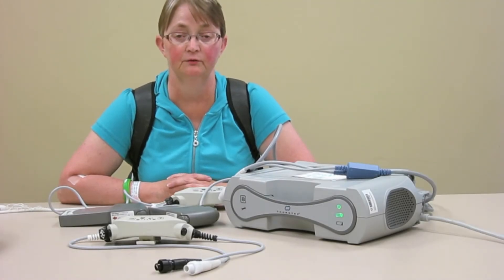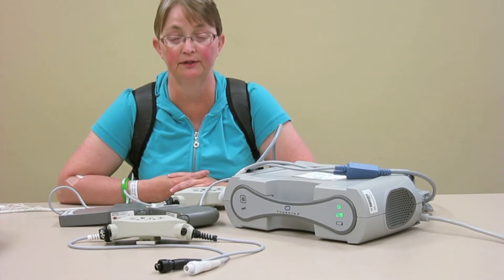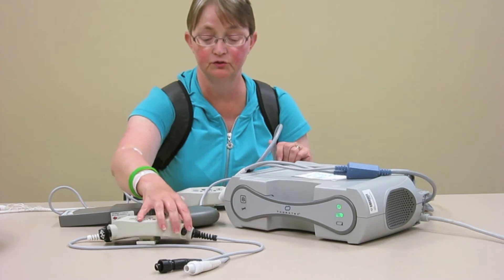One of the things you may have to do is change a controller if the one that you're using isn't working properly. It will let you know that it's not working properly, and so that's why you have a backup at home so that you can switch to the new controller.